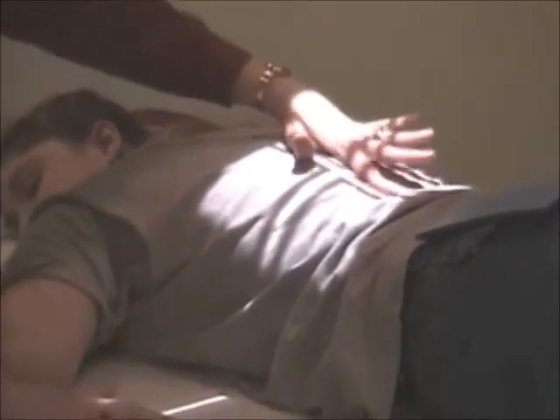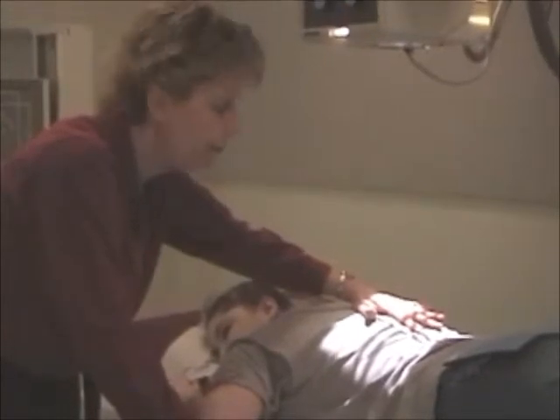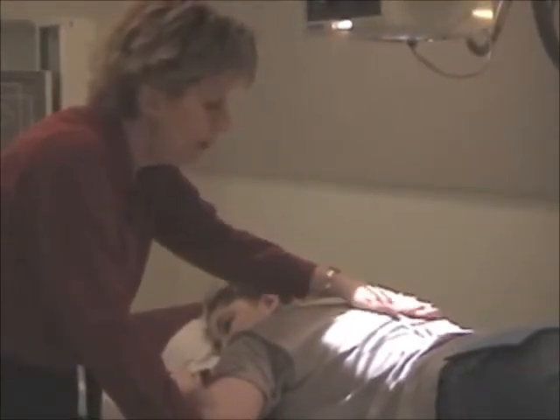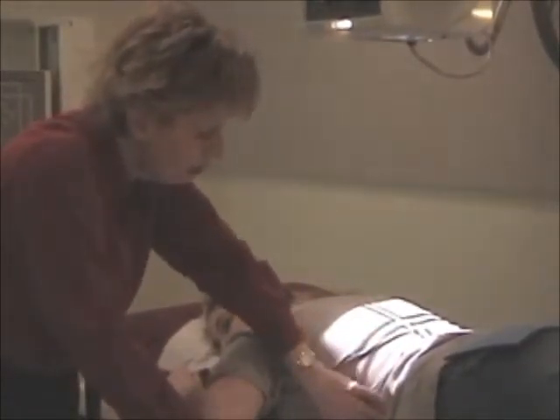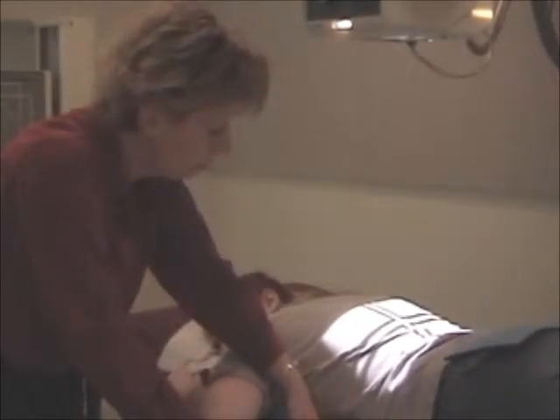And then side to side, here's her spine right here, and I'm 1 inch to the left of the spine. Because again, the stomach is fairly midline. It is on the left side, but just off of midline. So I'm happy with that placement. Then I like to look at the edge of the body here and make sure I'm not x-raying tabletop.